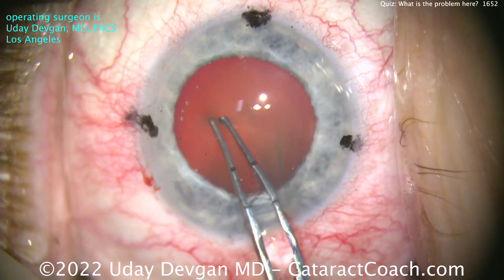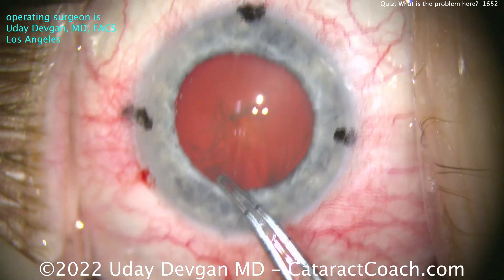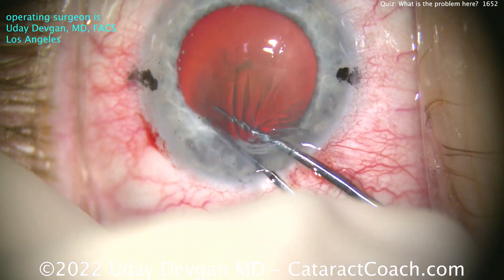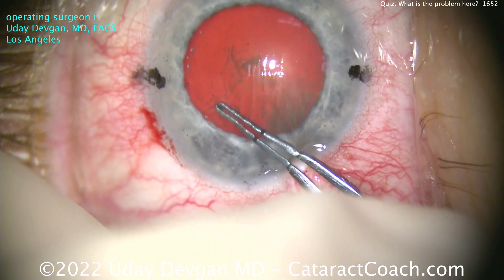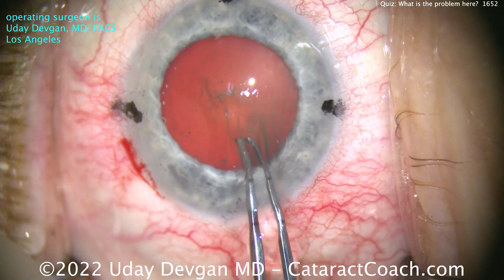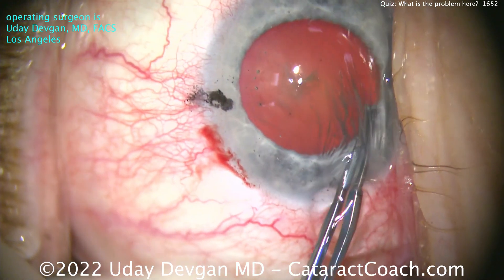I recorded this case and I'm presenting it because it's a fantastic learning point. If you're an experienced surgeon you'll know, but I want to show you a few initial steps here. We have a very nice rhexis, there's no issue there. A little bit tough to grab, but we're getting this — you can see the forcep tips are a little bit bent out of shape, we'll have to fix those. But we'll get a beautiful, nice five to five-and-a-half millimeter capsulorhexis.